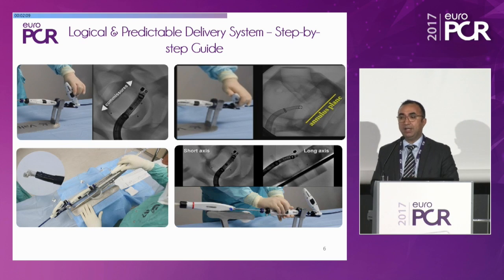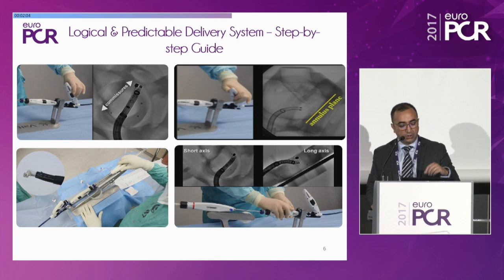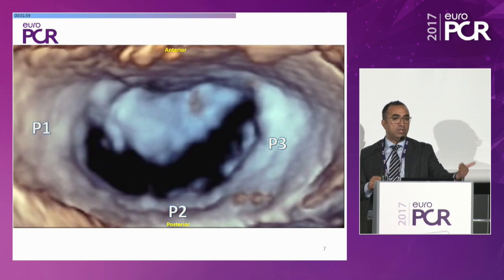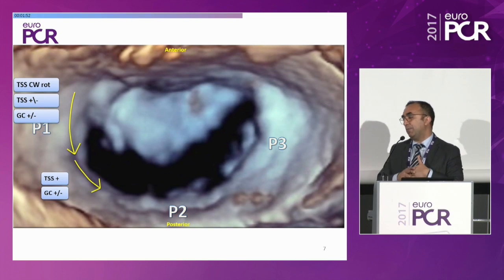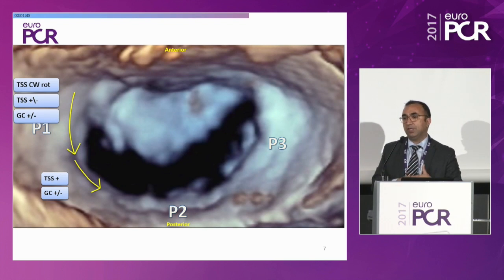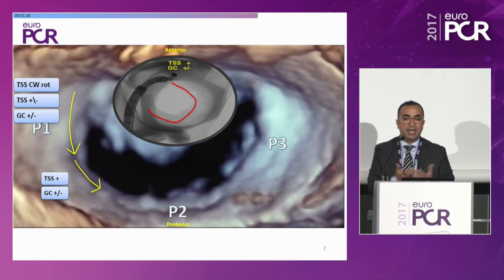So other than the simulator, I also wanted to know on each part of the annulus, what would I have to do? And so what they've done is broken it up. So when you're in P1 and you're near the trigone and you need to move along P1, they're reproducible steps you'll do every single time. So in about 90% of cases, you do the same steps over and over again. There will be cases where, because of retraction of the leaflet, because of the shape of the anatomy, or where you did your transeptal puncture, you may need to change that. But in most cases, you have what an airline pilot has.